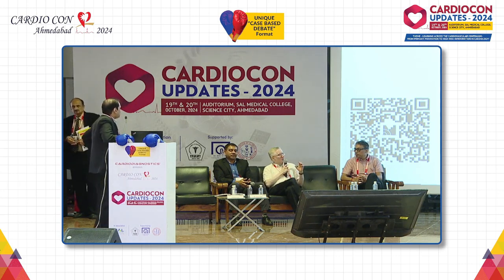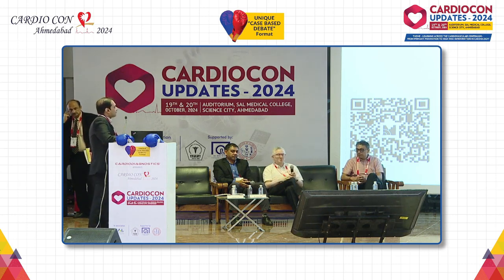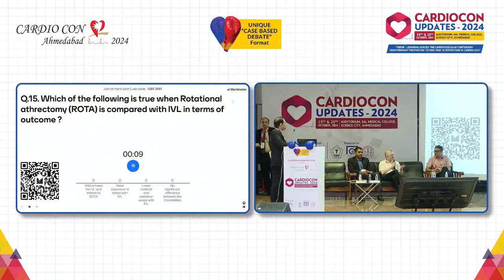IVL is the best device to treat the deep calcium. It is most effective for concentric lesions. Eccentric lesions and nodules, I think IVL is less effective. So no flow, what do you think is better, rotational or the orbital? For no reflow, I think the safest device is IVL for all calcified lesions. Orbital is the second safest device. Rota has the highest complication rate.